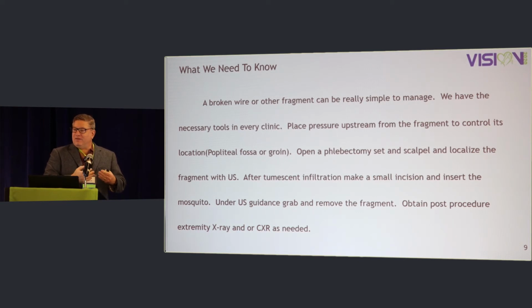The floppy tip, if it's not entirely in the vessel and you have stiff wire in the vessel as well, that's just to guide you around those little nooks and crannies, but you need stiff wire in the vessel. If you don't have stiff wire in the vessel, you're going to buckle it, and that's what I did, and then you're going to try to pull or push one way or the other to get the sheath in or whatever, and the next thing you're going to feel is a disconnect. It may uncoil or it may entirely come off.